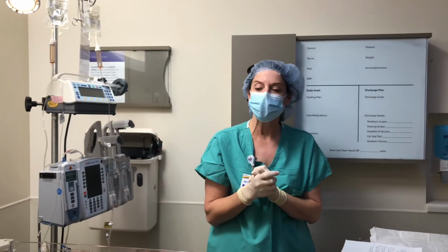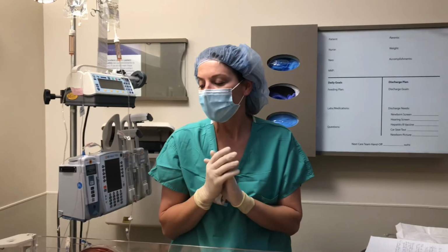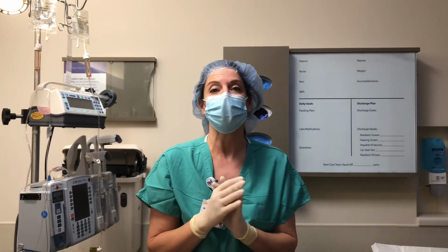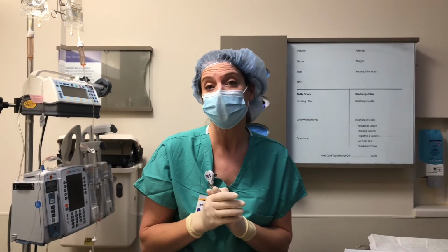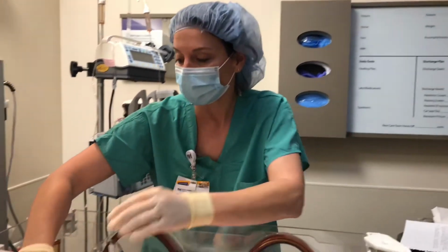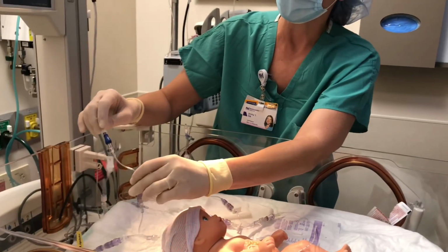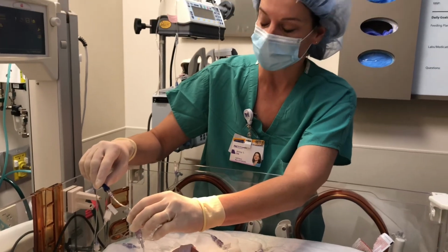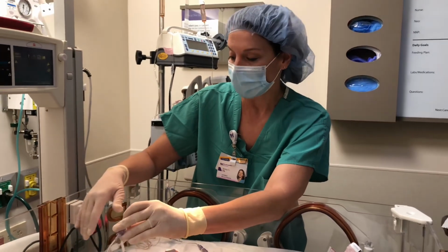Two final reminders, just to clarify, we standardized our practice, so we do have an IV filter on all IV fluids, so that includes peripheral lines, our PIVs, so those will also have your TPN or your peripheral IV filter, so all of our fluids are now filtered, clear fluids, TPN, and lipids.